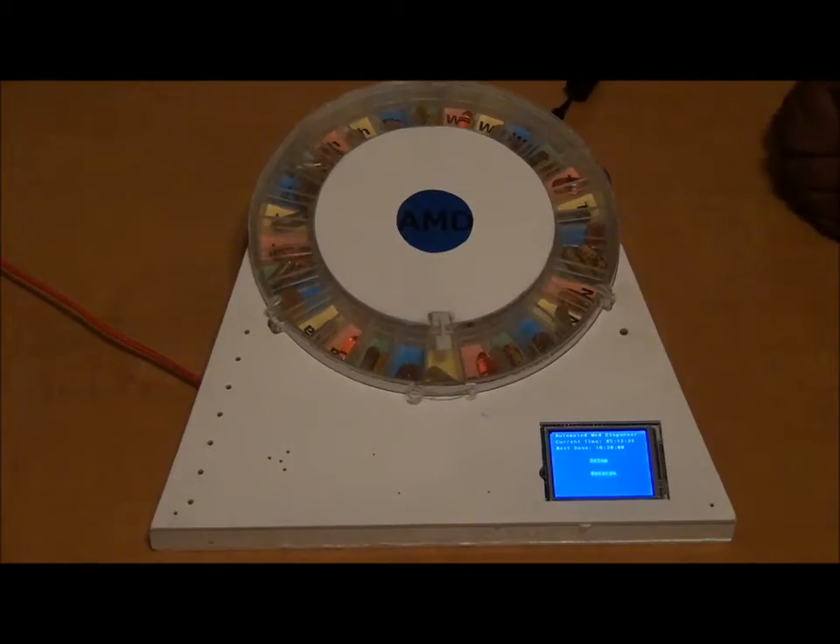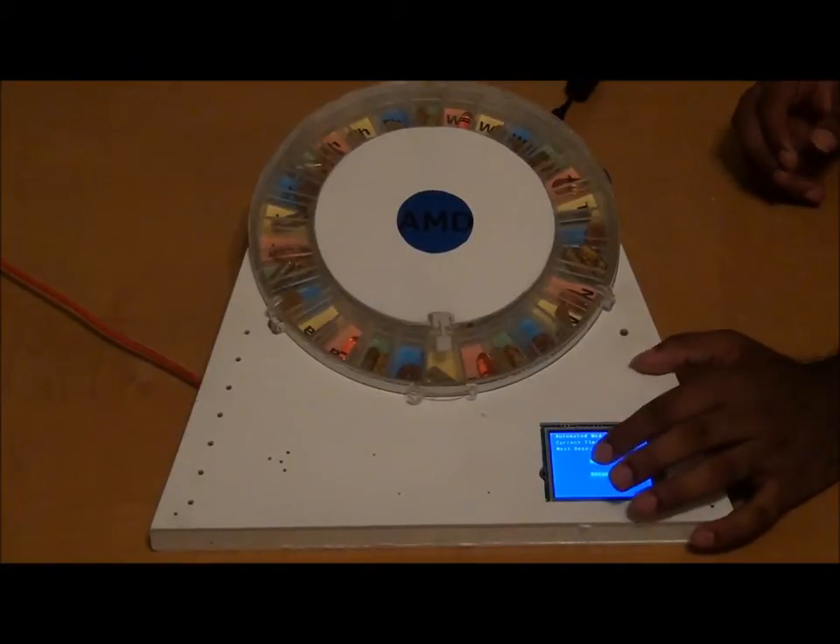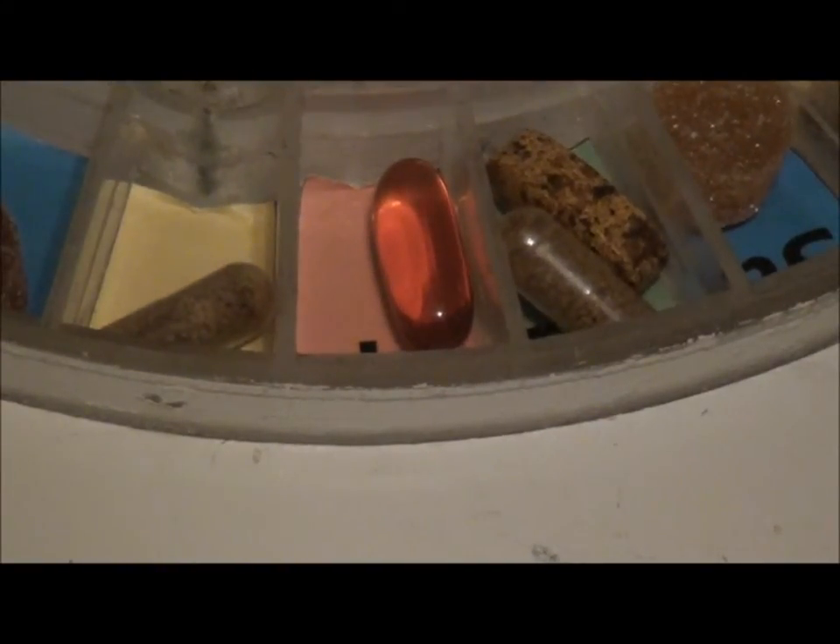Now is the time to take our medication. To do so, we simply press a button on the LCD screen. Now it's time for my medication.